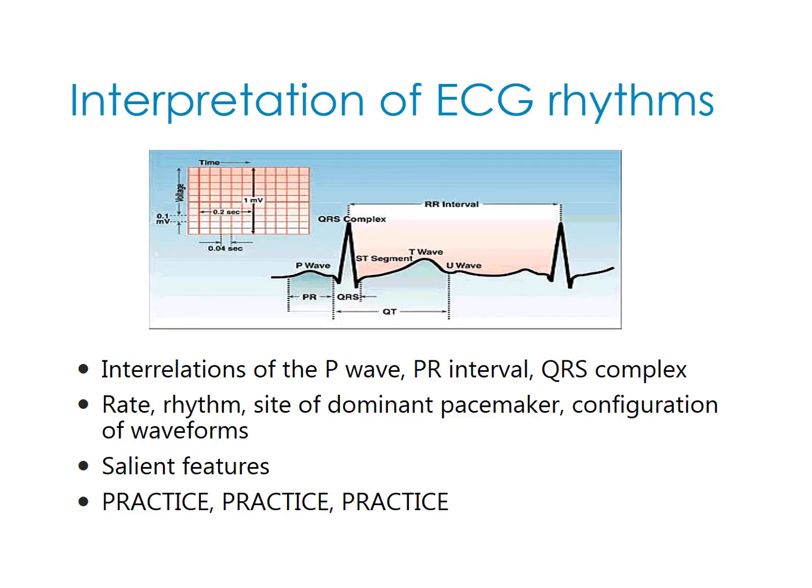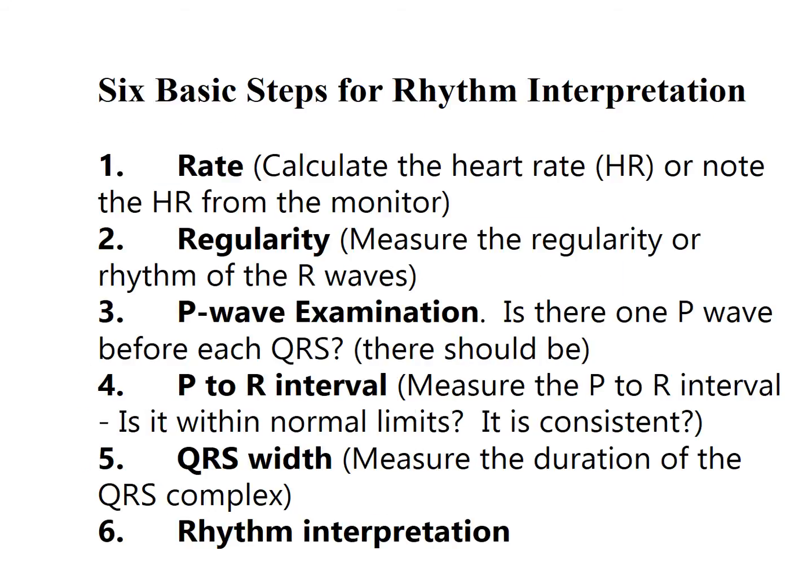If you are just thinking, oh my God, what the heck is she talking about? Don't despair. Once we start doing the hands-on stuff, you will see that this is such a good regimen of each step, which I am going to give you, that you will learn how to interpret basic ECG rhythm strips. So here are your 6 basic steps for rhythm interpretation.